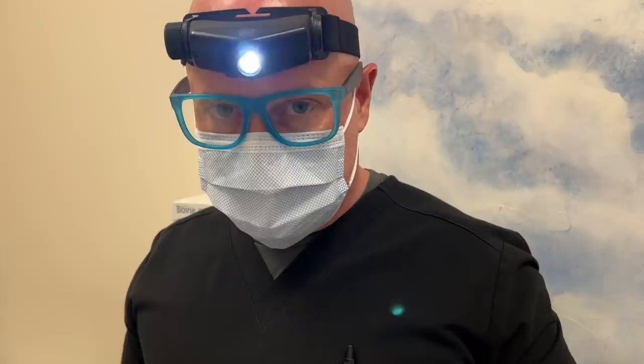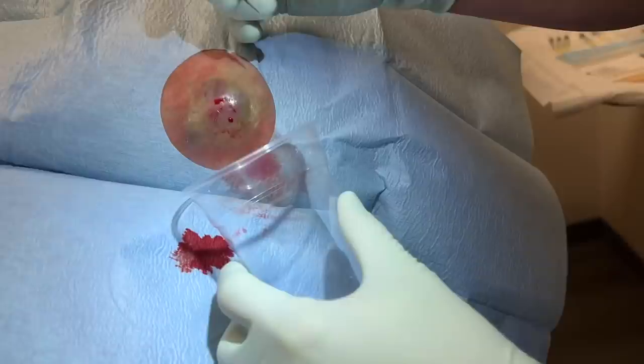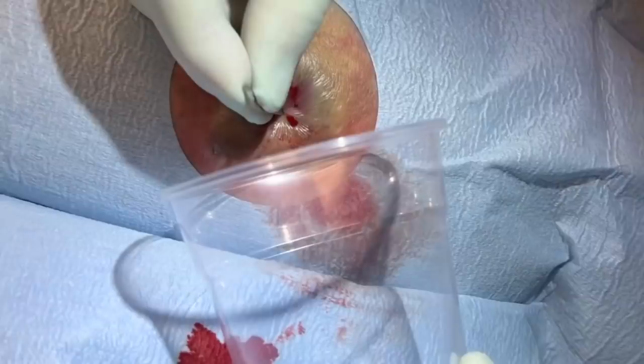We have the abscess prepped, ready, and comfortable, and we got some lidocaine in there. As we know with the acid-base shift, it doesn't take away all of the pain but usually it takes away the bad stings. So we got her ready here and this is likely a pretty good fluid pocket. We're just going to make a little cut here and then drain some of this fluid, and then see if we get any chunks of cyst or anything like that.